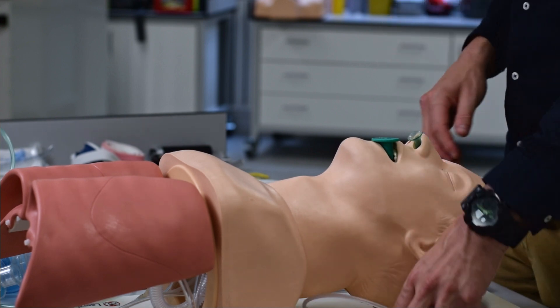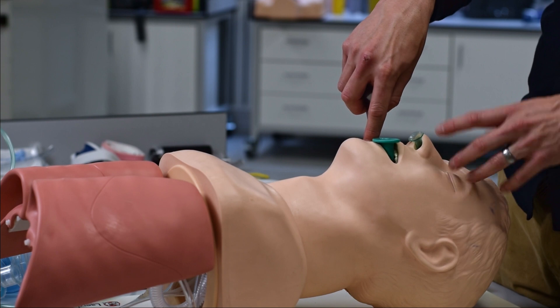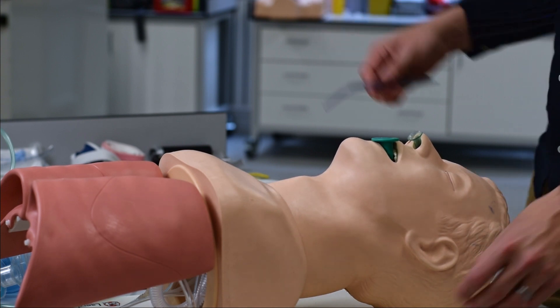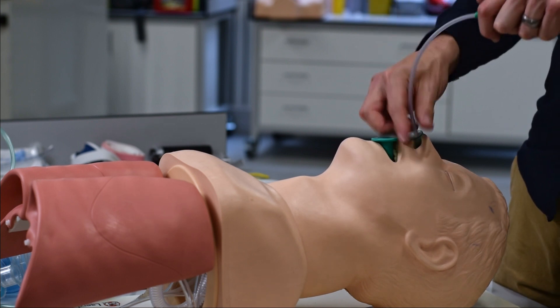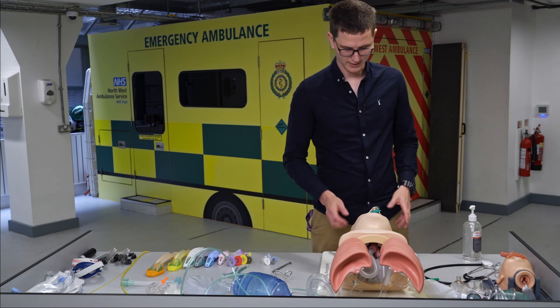The last and very important point: the longer you are suctioning, the longer the patient is apneic. You cannot suction and expect the patient to be breathing. Limit suctioning to 10 to 15 seconds at a time. If the patient is intubated and you take them off the ventilator to suction, the longer you're doing this, the longer they're not breathing. Be very aware of that.